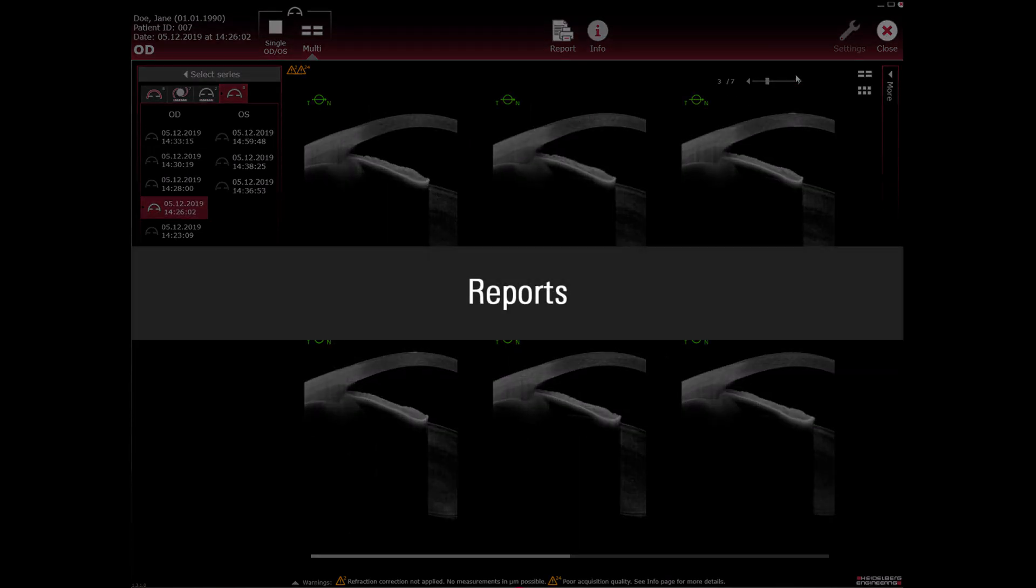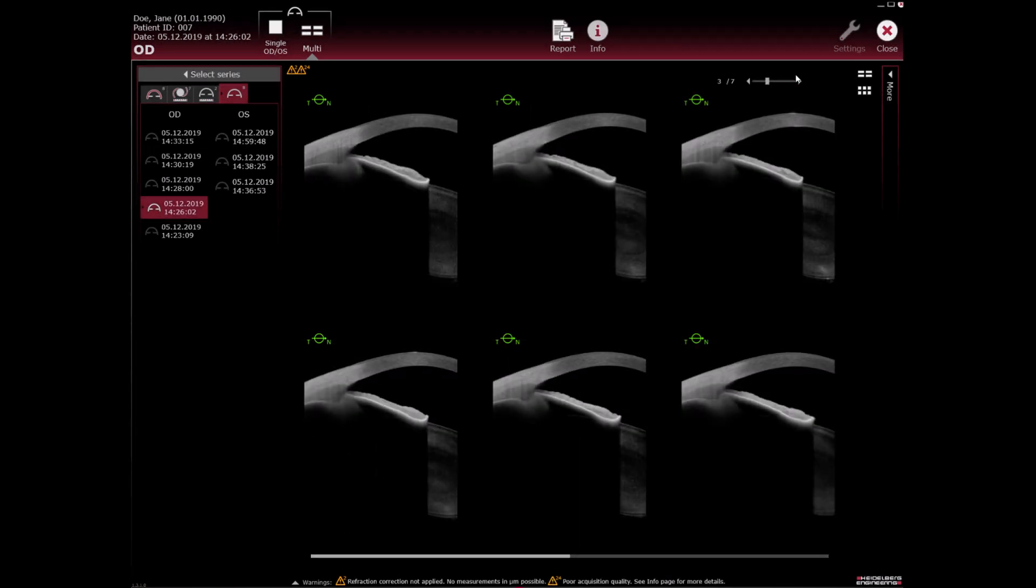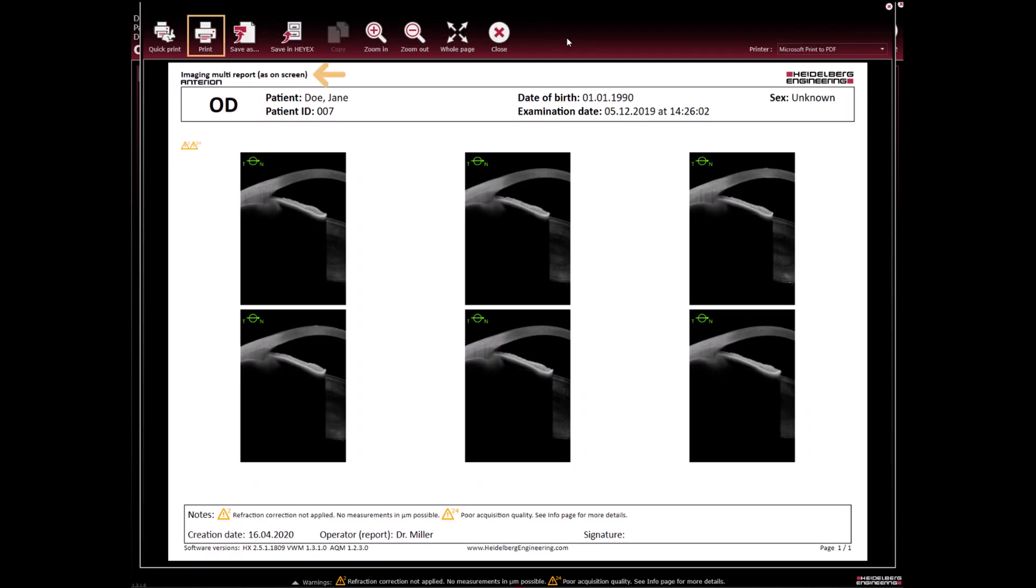Reports: Views that have been customized in the analysis window can be printed as a report. Select report. Print the template report as on screen.